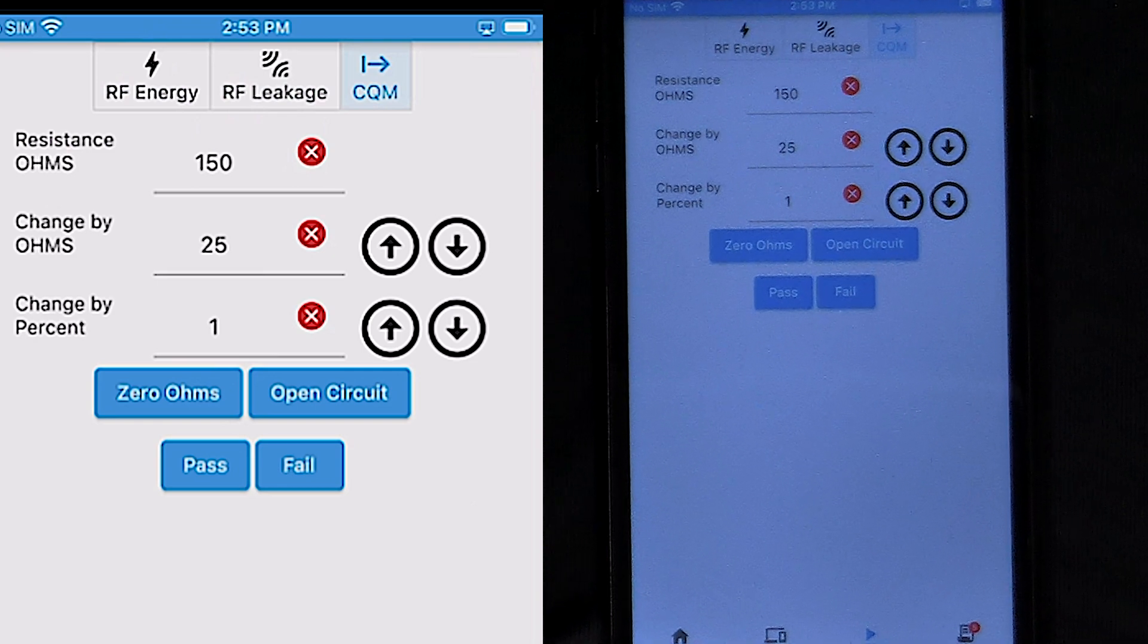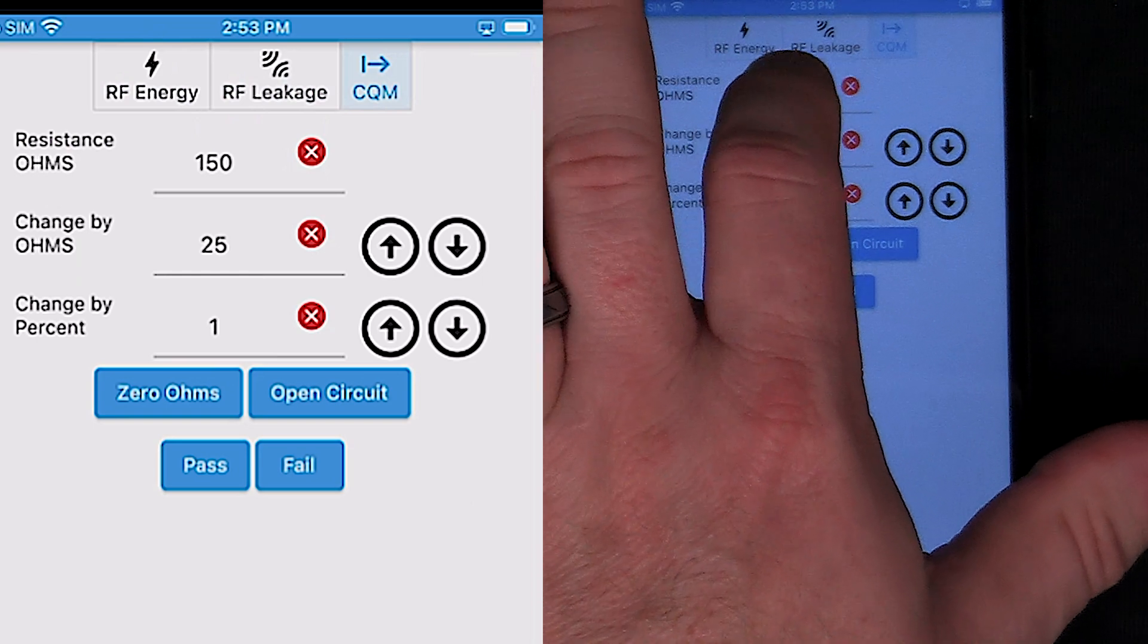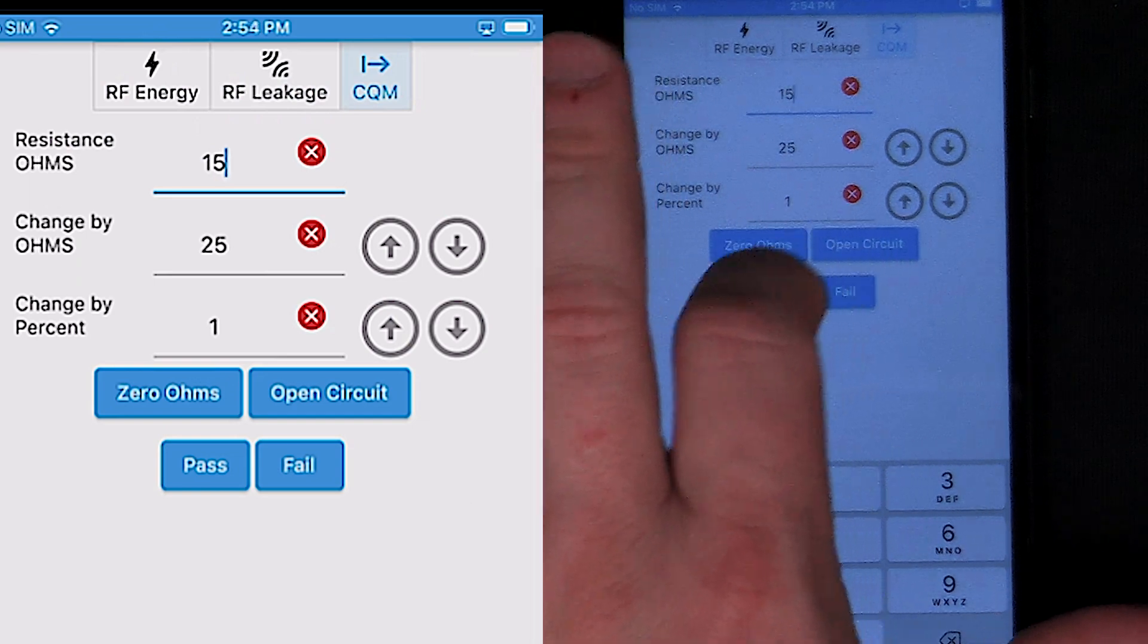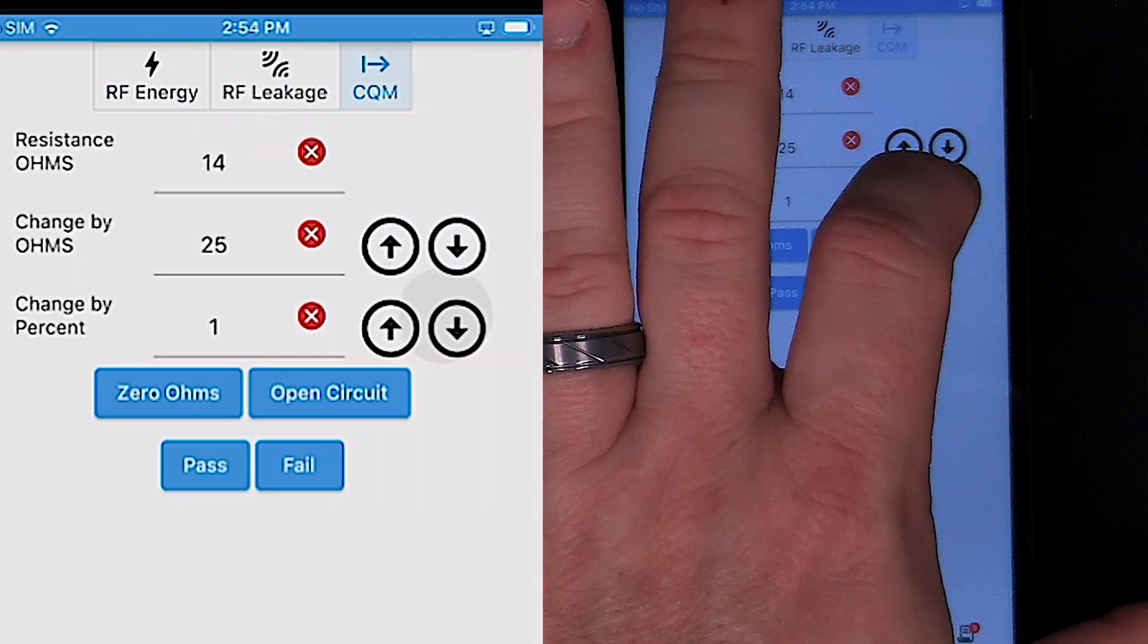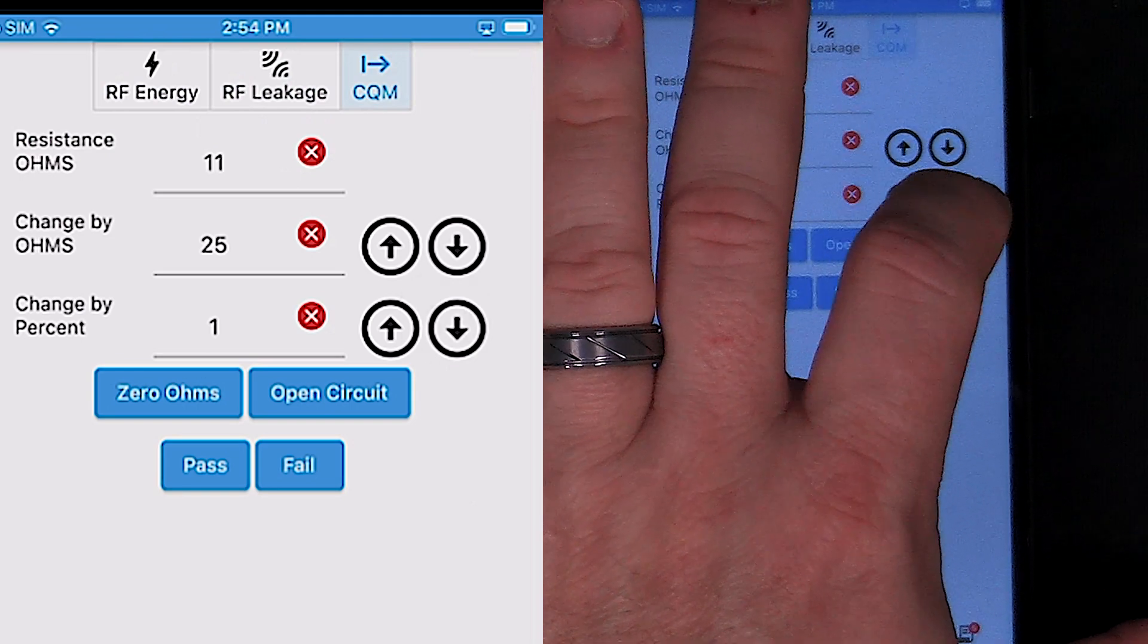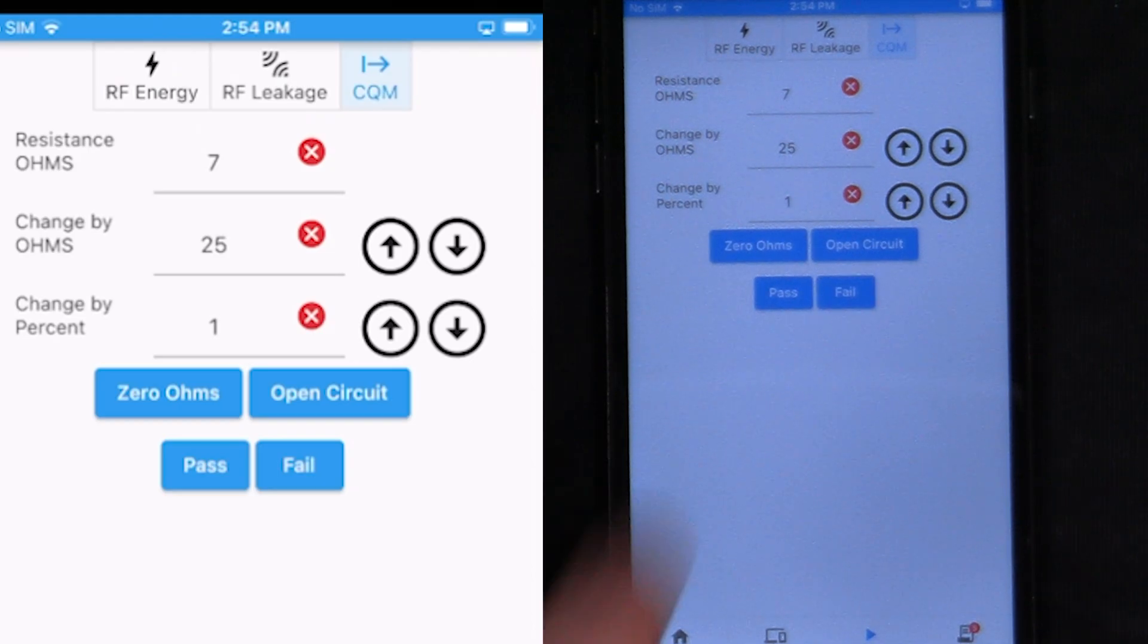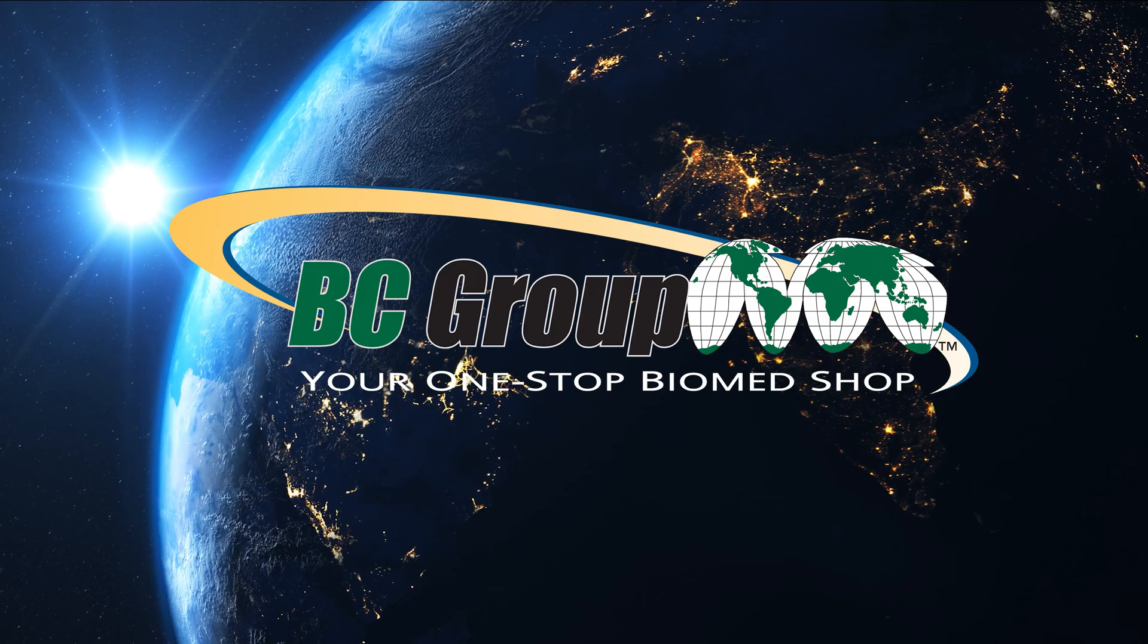And then the same thing for this split electrode, we can set this to, say, 15 ohms. And we can decrease the resistance. And we would look for the point where the generator goes to an alarm condition. And here it happened at 7 ohms. So we can say that's a pass. We can follow the service manual procedure for checking out the REM function.